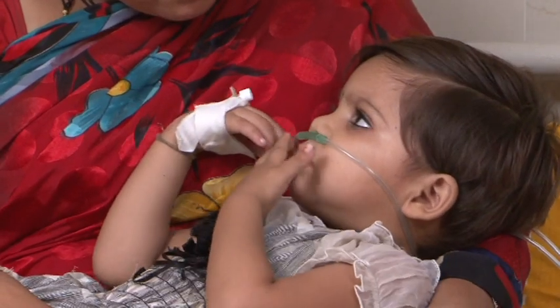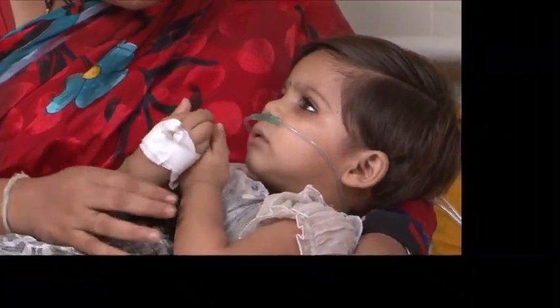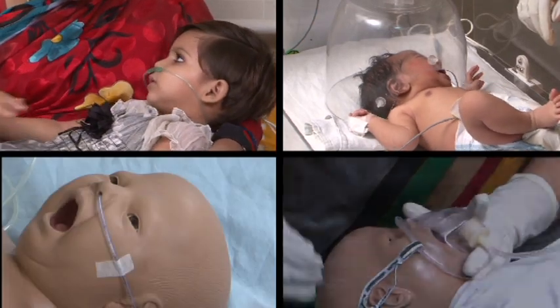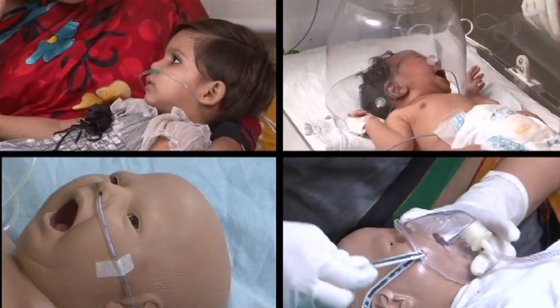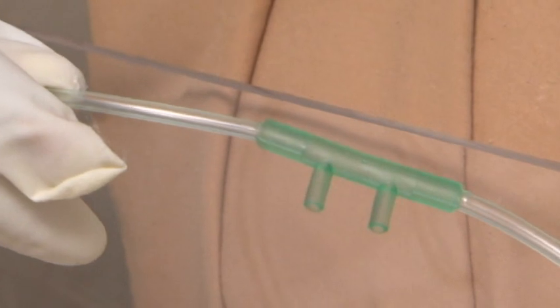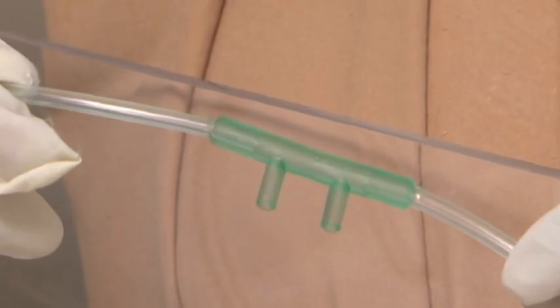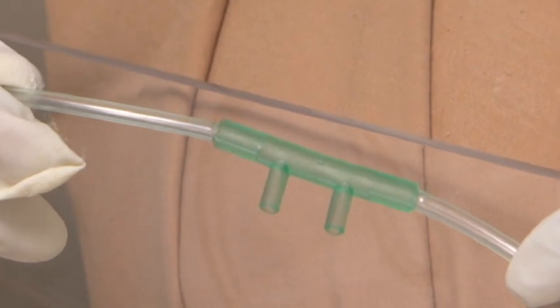Oxygen delivery. Oxygen can be administered using nasal prongs, oxygen hood, nasal catheters and face mask. Using nasal prongs. Using nasal prongs is the safest and preferred method for oxygen delivery.